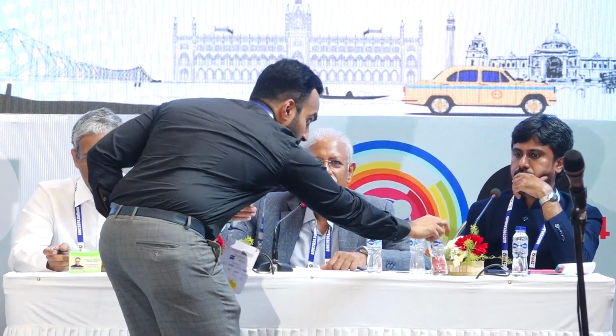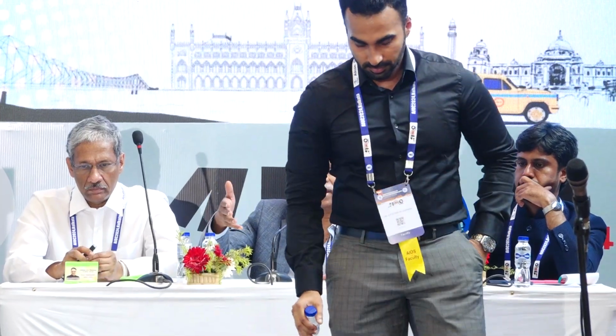It's quite important for us to understand that what the patient is sometimes complaining of does not fall into what we are potentially observing. So it's common to see the case sheet that comes up to you where it says 6/9 N8 or 6/6 N6, but the patient is bitterly complaining of poor quality of vision. I can't see clearly. Everything is waxy. So when you do aberrometry studies, that throws out what exactly is going wrong.